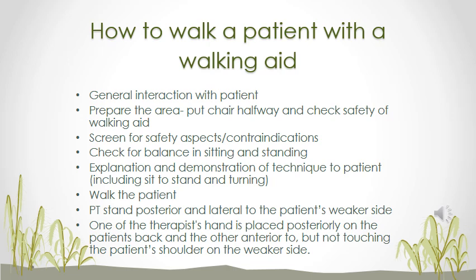So one of the therapist's hands is placed posteriorly on the patient's back and the other in front, but not touching the patient's shoulder on the weaker side per se. You will see what they need while you are in that position.